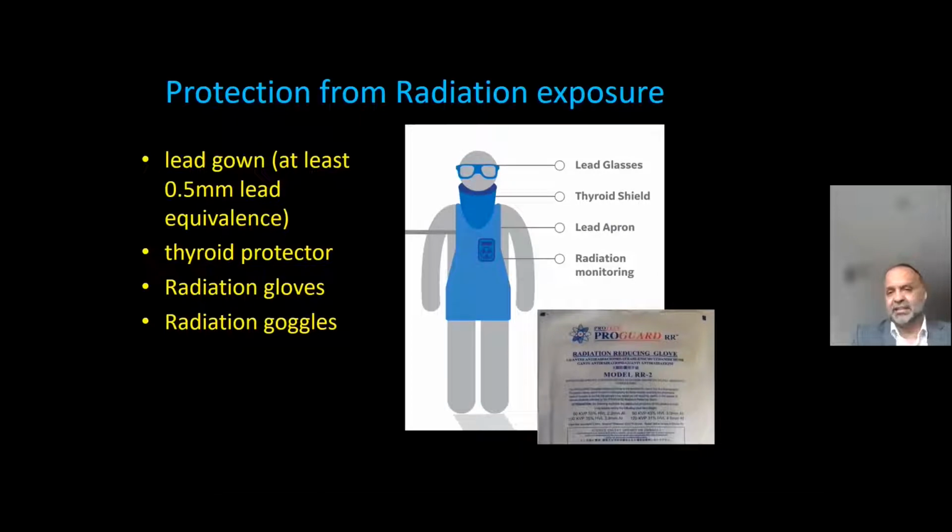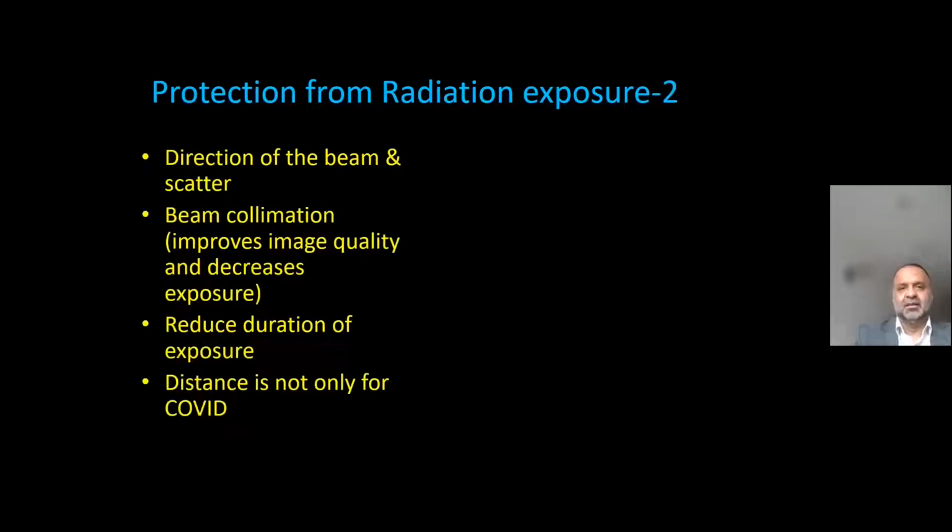Radiation gloves, as you can see in the picture, in one of the trusts that I work in, we have these radiation protection gloves. Now they reduce the dose of radiation significantly. Although one of the trusts where I work, they don't have these radiation gloves. Then radiation goggles, again, at another hospital, a private hospital where I work, they would provide radiation goggles, but the majority don't have them. If you can have them, it is brilliant. They're not easy to wear though. They are fairly heavy.